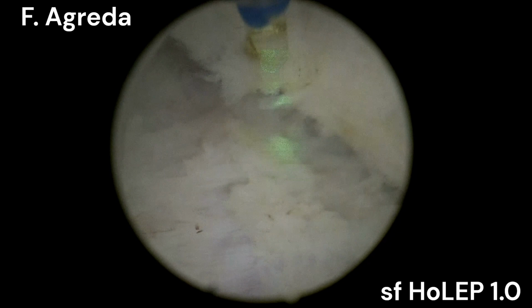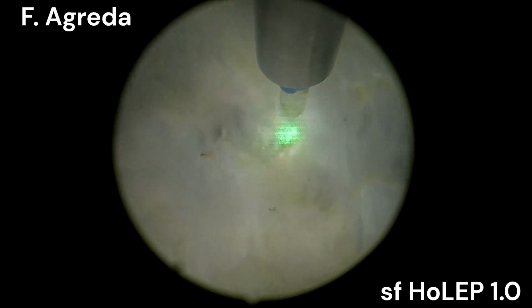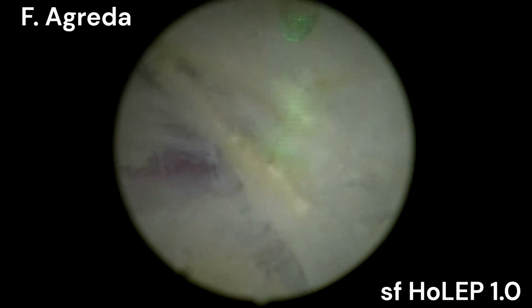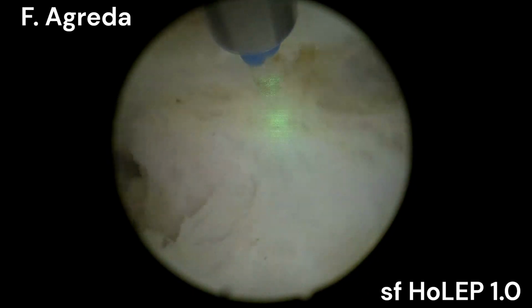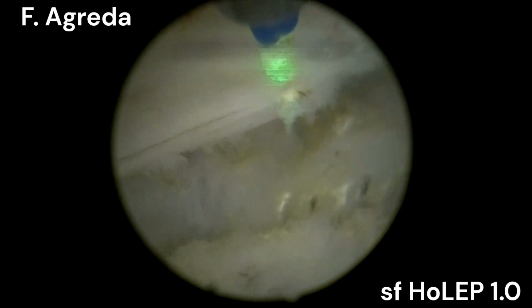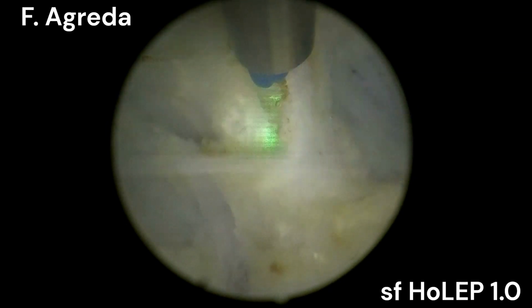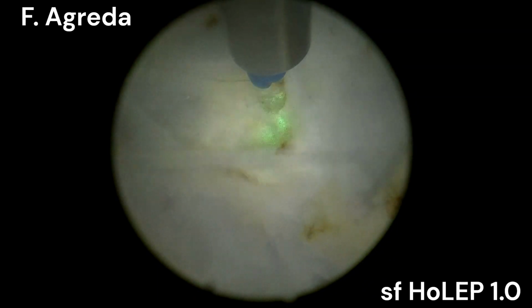I'm going from one side to the next, from 4 to 8 o'clock, in a progressive manner, releasing the prostate and trying not to cause any perforation. Don't detach the adenoma from the capsule with mechanical force or blunt dissection, always using my laser, to do it in a more controlled, progressive and very active manner.